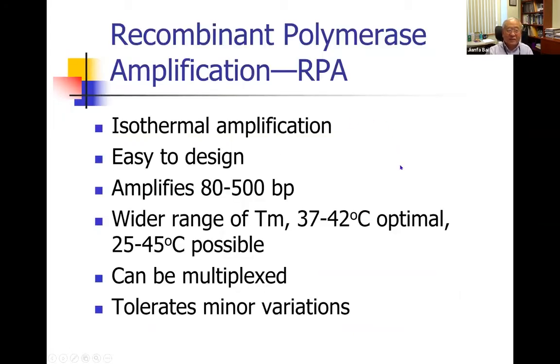But in recent years, some other technologies have been invented for point-of-care diagnostics, called RPA, recombinant polymerase amplification. It's similar to LAMP. You don't need a machine. You can do it on the farm. However, it only uses a single pair of primers, so it's much easier to design. I envision this technology will probably slowly replace the LAMP technology.